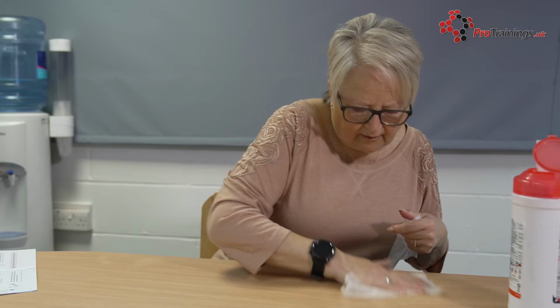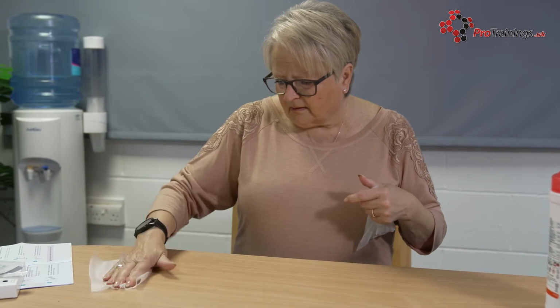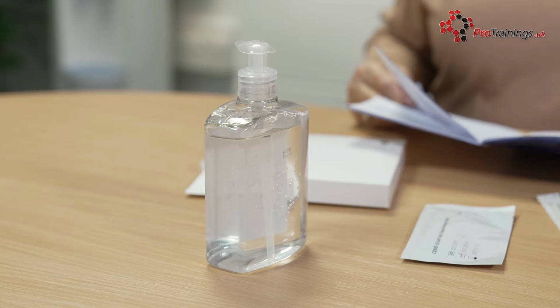First, prepare the test by reading the instructions carefully. Clean and dry a flat surface where you're placing the test. Wash your hands thoroughly for 20 seconds with soap and water, or use hand sanitizer to avoid contaminating the test, and dry your hands. If doing more than one test, wash between tests.